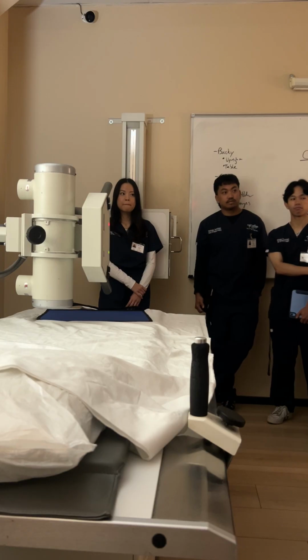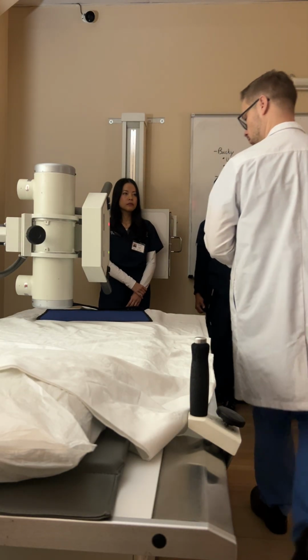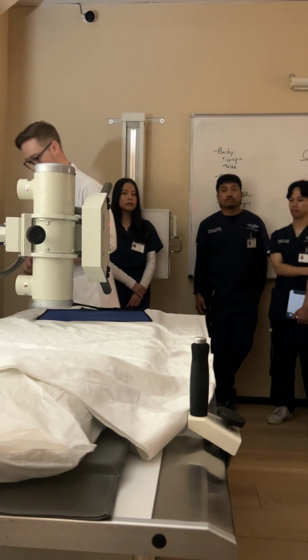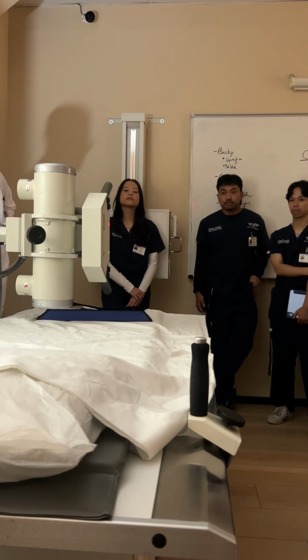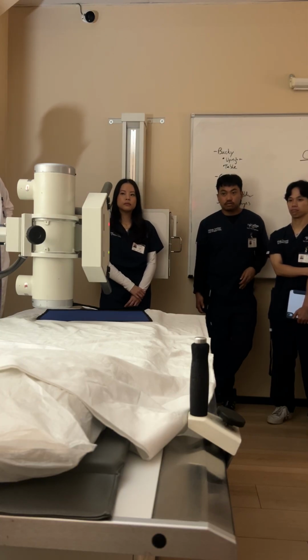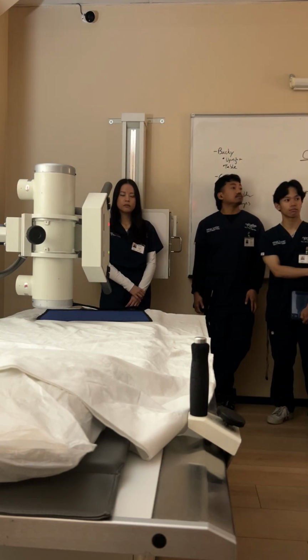Questions? Is that because they're not leaning against something? Yeah, because you're on your side. So once you're taking that deep breath in, I just reach forward. But when you're against it, you can do it, and you feel it there.